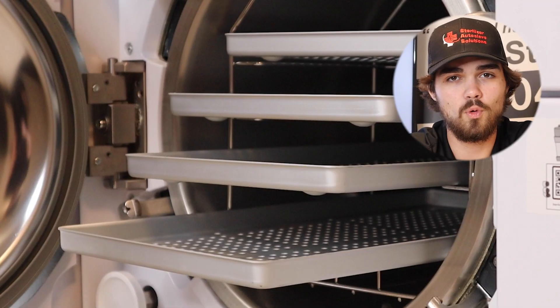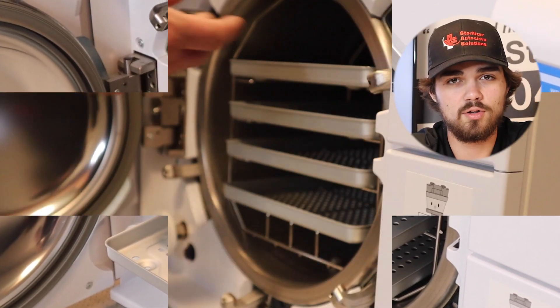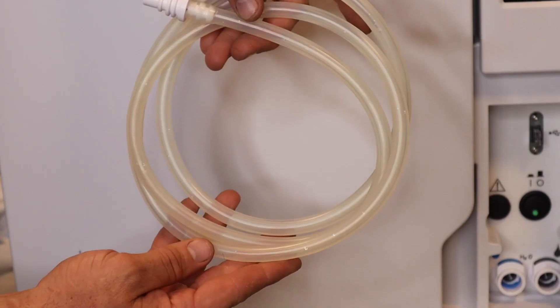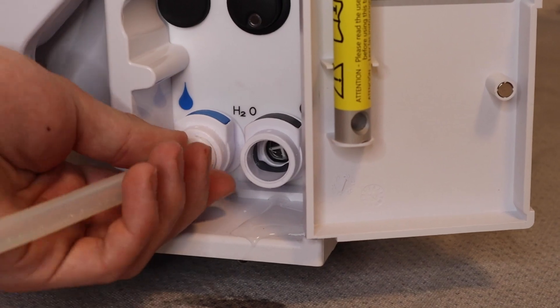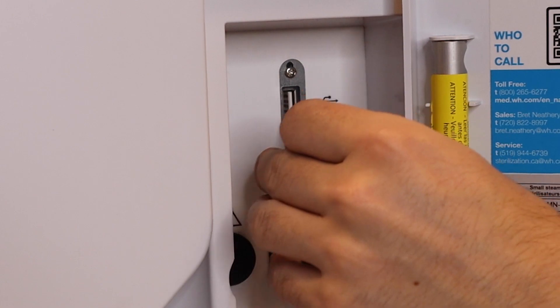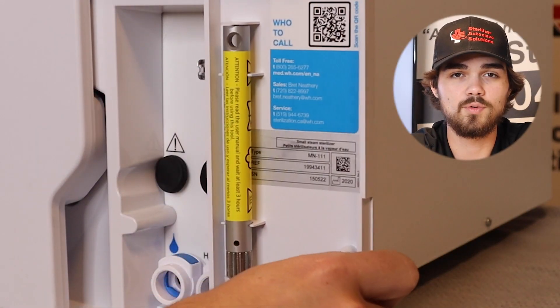The unit comes with four aluminum trays. It also has a reversible rack to accompany those four aluminum trays. The drain tube is also included. You have a USB drive from factory, and a door unlocking tool.